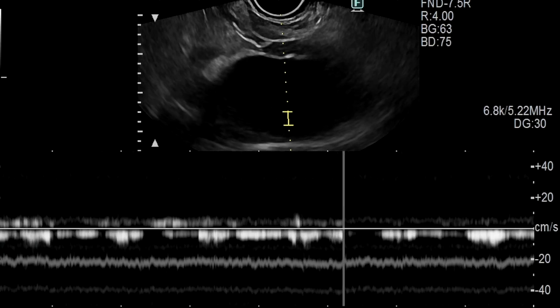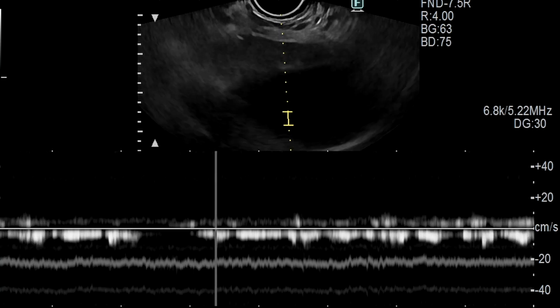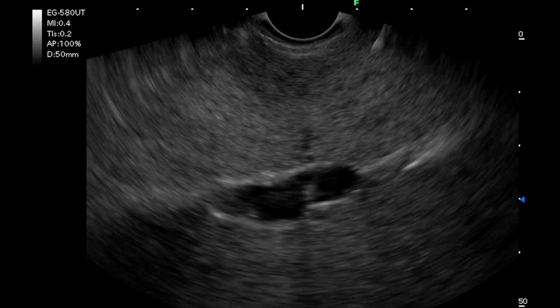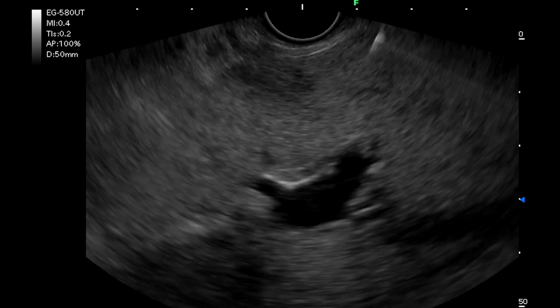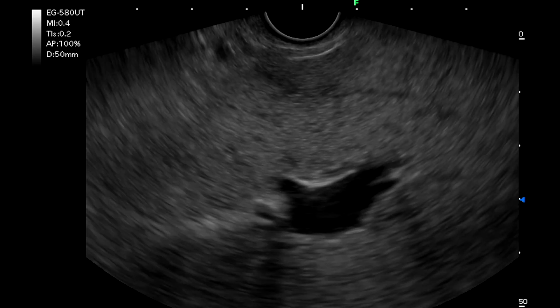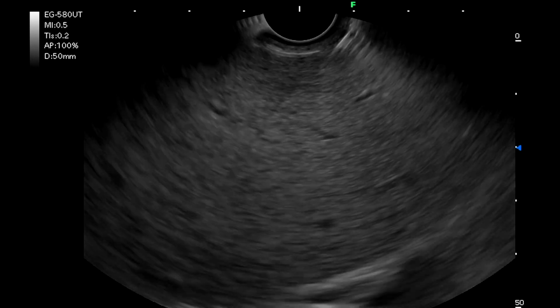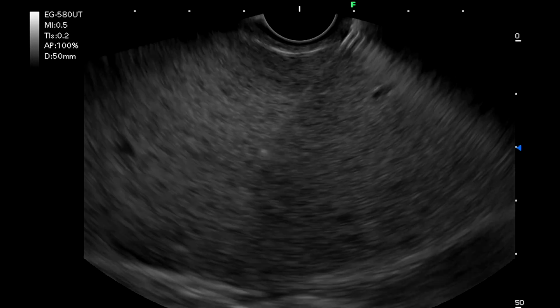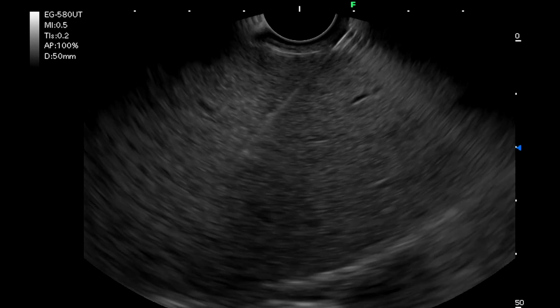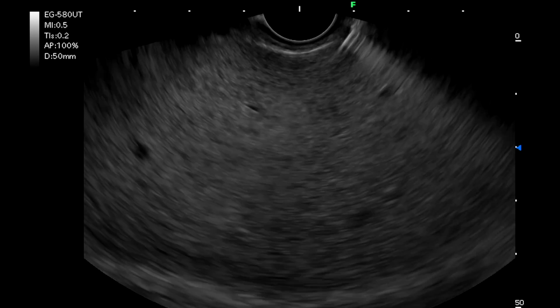The portal vein was punctured, and the average of three readings was obtained to be 28 mmHg. As the pressure gradient was 13 mmHg, the patient was diagnosed to have portal hypertension. Subsequently, a liver biopsy was performed at the request of the hepatologist in the same setting for assessment of disease activity.